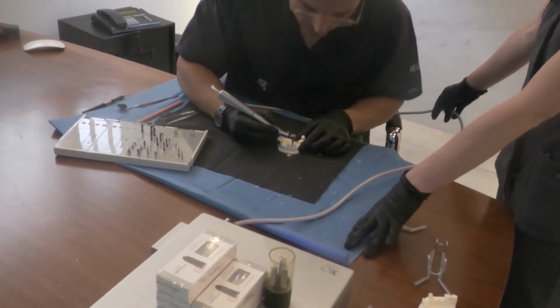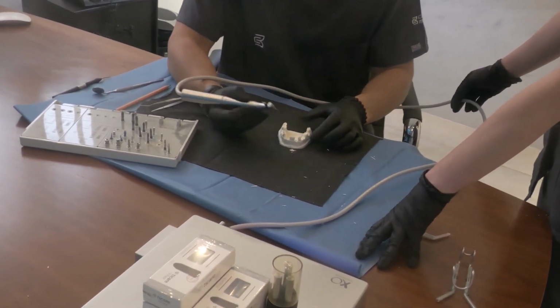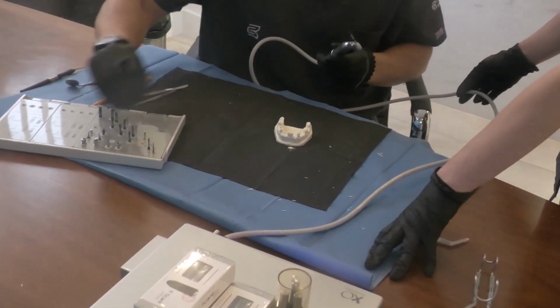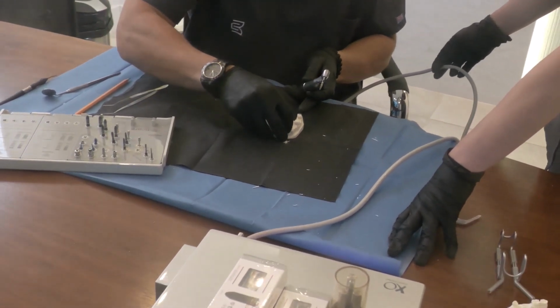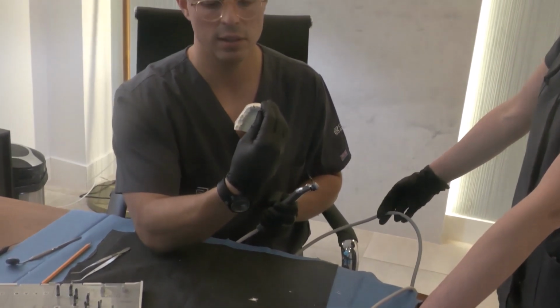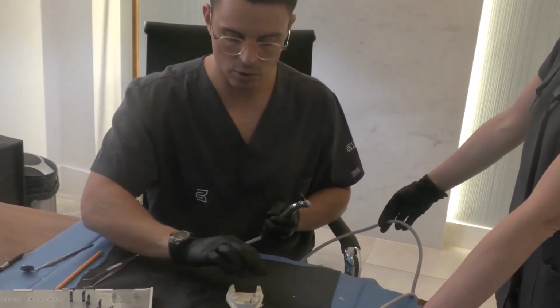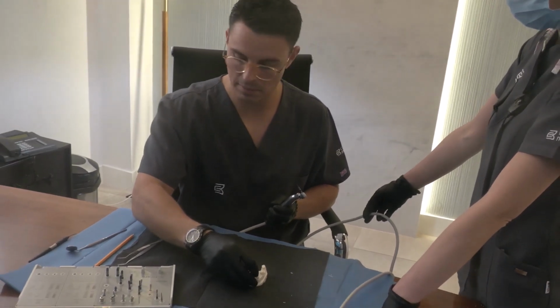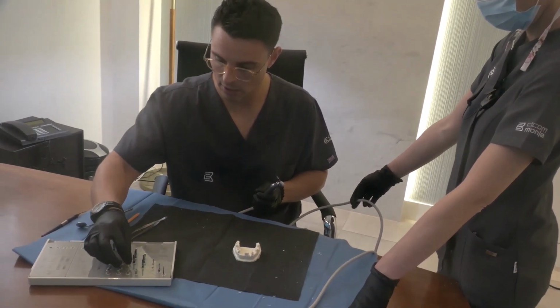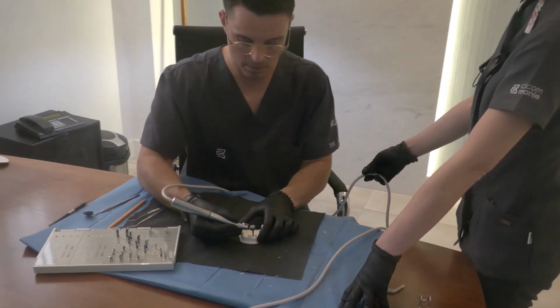Okay, and you have to make sure at this stage that the implant position is right. For that, again, you can use the drill, the pin, and here you can see that the cingulum position is the one that is being done, and that also in the mesiodistal perspective and in the buccolingual context are within the standards.